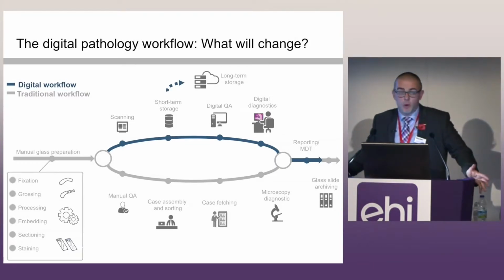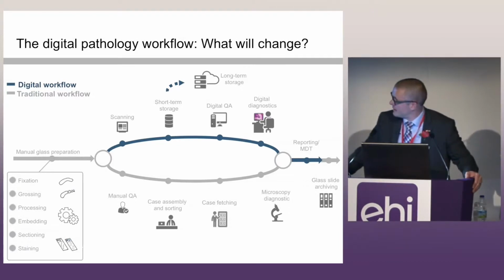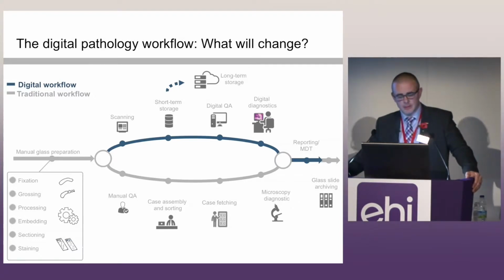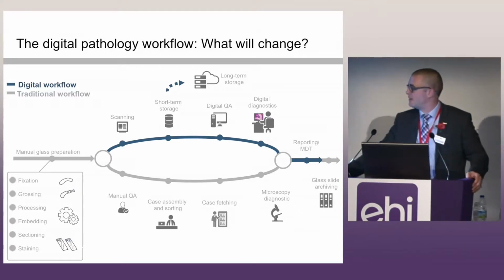So, what will change? Quite a lot, but not so much as well. If you look to the left of the PowerPoint slide there, there's a whole heap of processes that will remain. You still need to acquire that section from the human body. It needs to be fixated, cut up, processed, embedded, sectioned, and then stained for visualization.